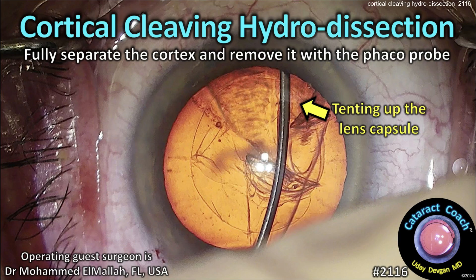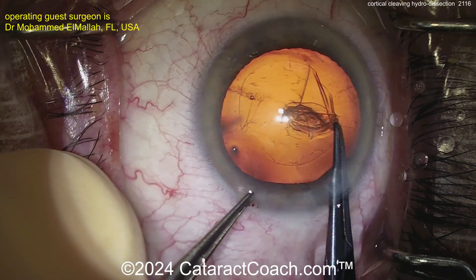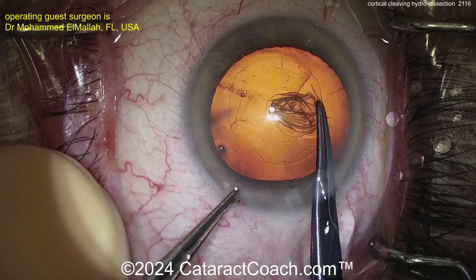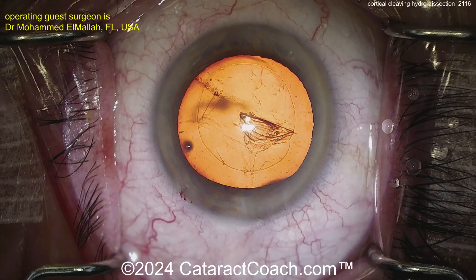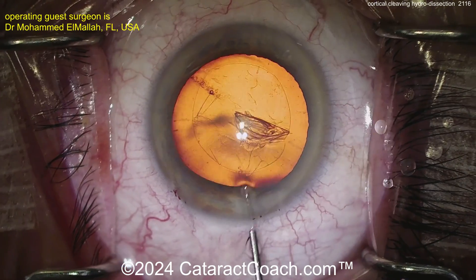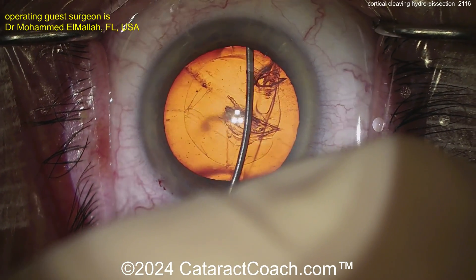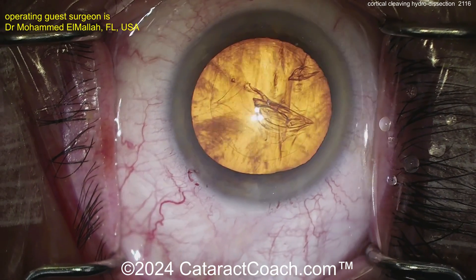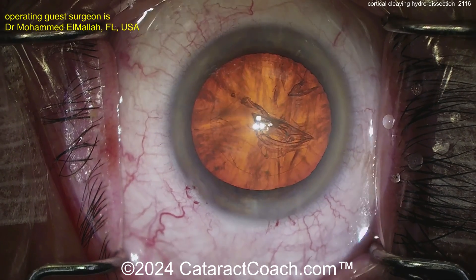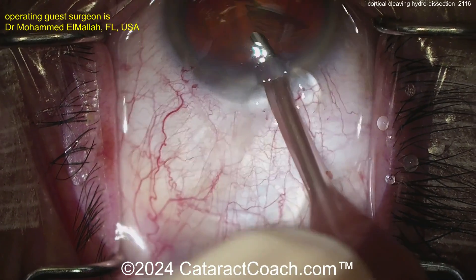CataractCoach.com — Cortical Cleaving Hydrodissection: fully separate the cortex and remove it with the phaco probe. This is a technique learned from Howard Fine many years ago. There's a nice capsulorhexis here, and the trick is the hydrodissection — Cortical Cleaving Hydrodissection — to separate the cortex from the capsular bag. The cannula goes in, tenting it up, and you get that fluid wave between the outer part of the cortex and the capsular bag, which frees up the cortex completely.